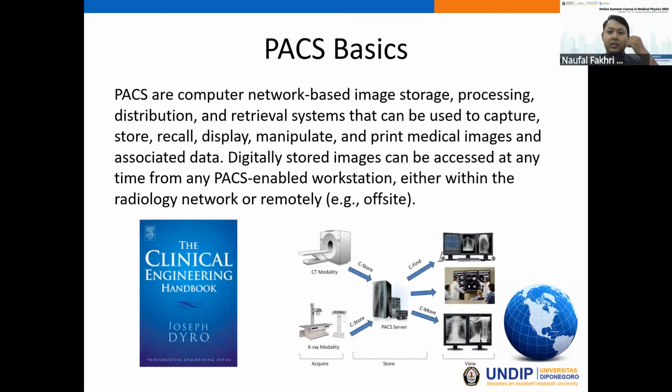So what is PACS? Maybe some of you already know about PACS, especially the audience working in the hospital. PACS basically is a computer network-based image storage, processing, distribution, and retrieval system that can be used to capture, store, recall, display, manipulate, and print medical images and their associated data.